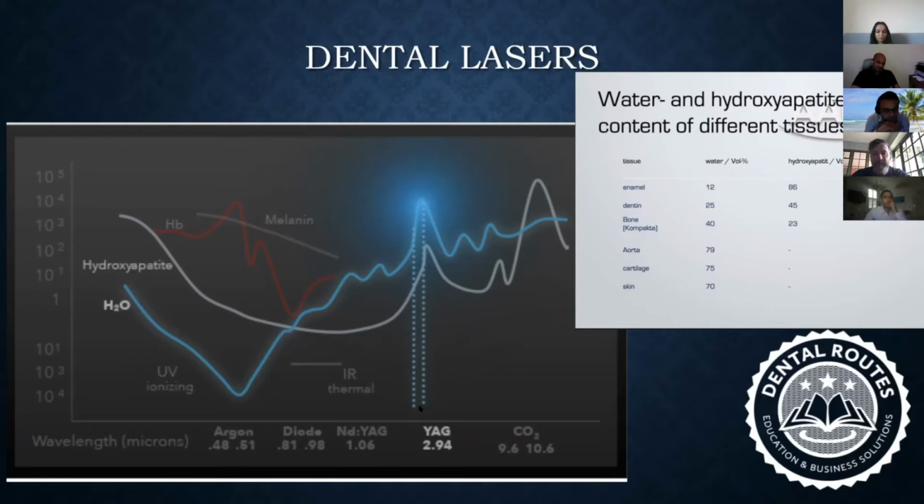Today's discussion is especially going back to the same particular laser, which is called an Er:YAG laser, which is at 2940 nanometers. This laser is of high interest for me and for us for discussion, because we consider this laser as an all-tissue laser. The reason why we consider this an all-tissue laser is that it has a very high affinity for water and hydroxyapatite crystal, so we can use it consistently on hard tissues. But since it has a very high affinity for water as well, you can very well use the same laser for soft tissue as well.